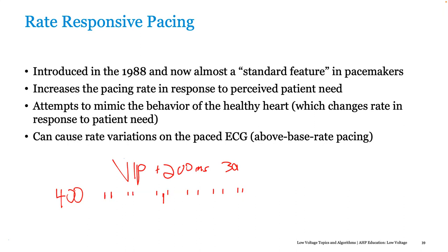Yes. I think that a lot of times in the US, we have access to the ones we need, so it's less of a conscious decision before a procedure. But here, having these varied devices at your fingertips, you really need to think about what the patient indication is and what they need it for. Maybe don't give them a device that has all the benefits they're not going to use, and save that for the patient who will use it. Same thing with that VDD lead. If we know we're going to pace in the atrium, then we're going to put an atrial lead in. I don't envy the added steps in your decision-making process, but it's definitely something to keep in mind when you're selecting devices.